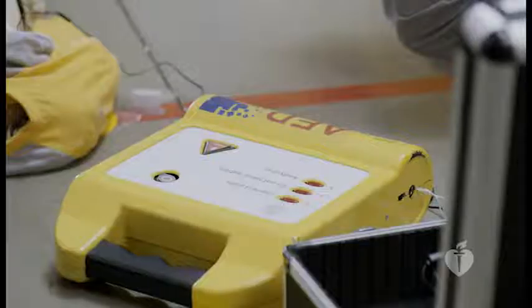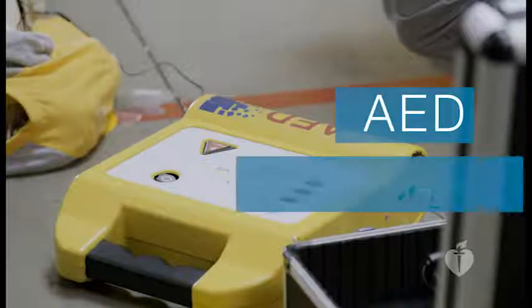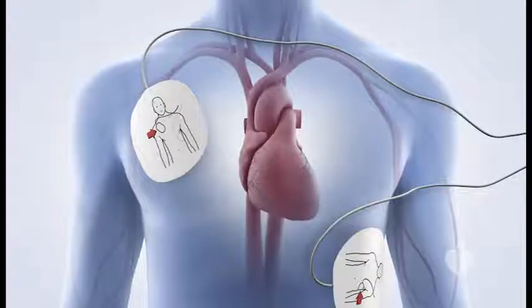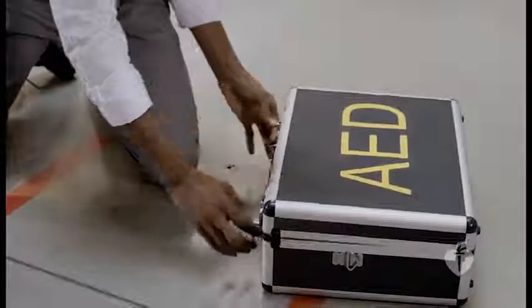You've learned how to provide compressions and give breaths to a child. Now we'll cover how to use an AED. AED stands for Automated External Defibrillator. It's a machine with a computer in it that can detect abnormal cardiac rhythm that requires treatment with a shock. The AED can then deliver that shock to eliminate the abnormal rhythm and allow the heart to start beating again normally.